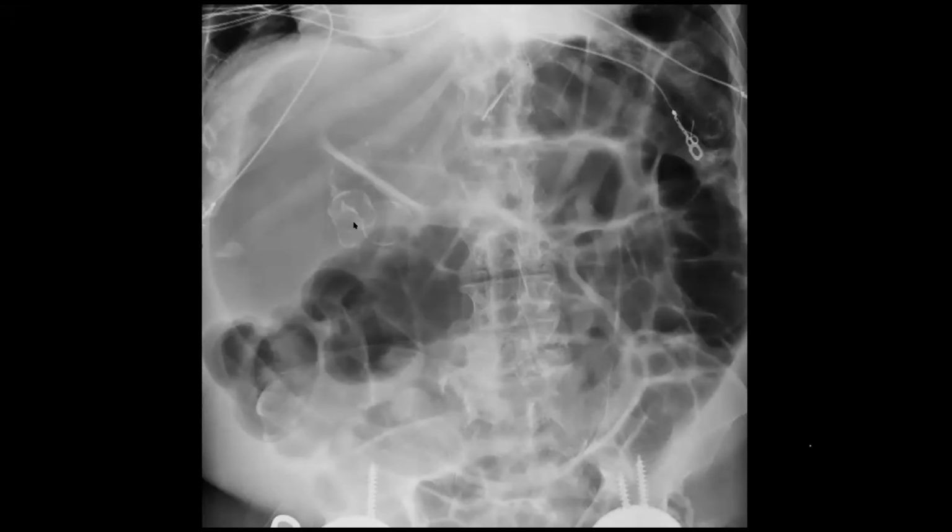And then another thought, somebody said porcelain gallbladder, which usually again would be the shape of the gallbladder. And I like the kidney thing, the atrophic kidney that's calcified. Okay, so good, a kidney. And then another person brought up a calcified adrenal. That's another great thought: adrenal cortical carcinoma could have central necrosis and calcs in it. And I think like 30 or 40% have calcifications, whereas pheochromocytomas usually don't have calcs.